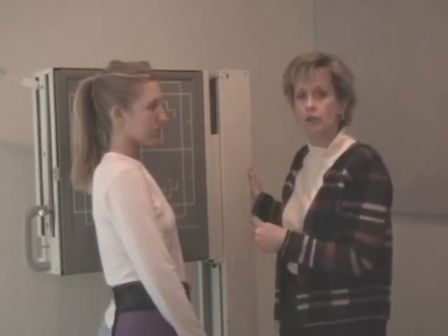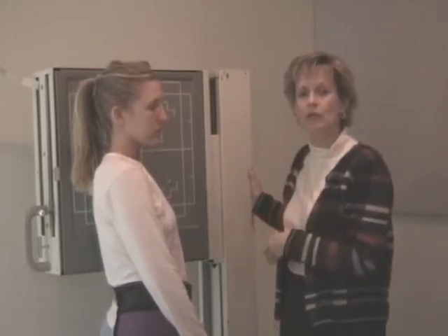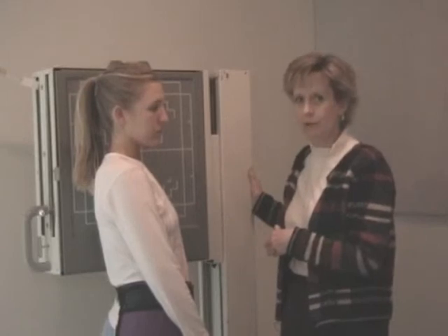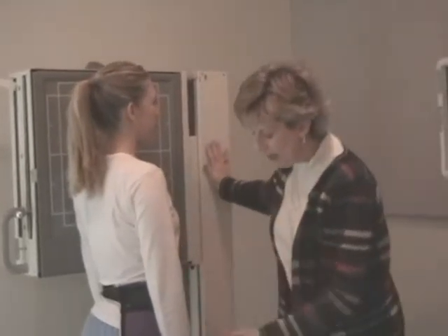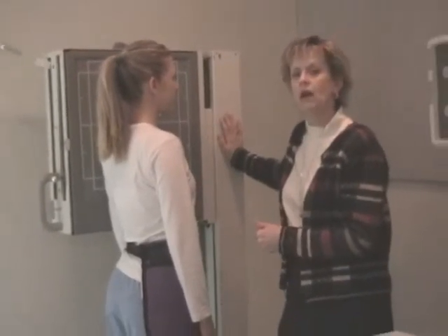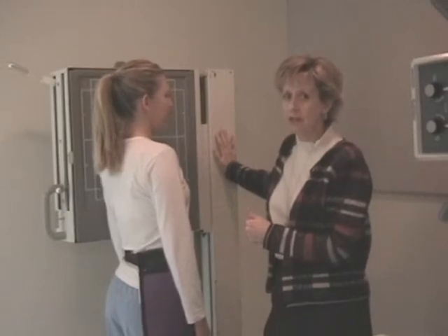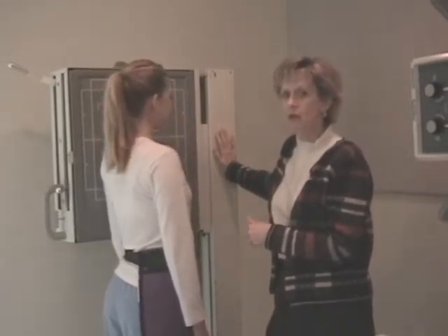Young children with these flipper teeth to save a spot in case they lost a tooth till their permanents come in, or the elderly with dentures. Make sure you put them in a safe spot. So we're going to have our patient stand. I could have them sit, but standing, the exam is fairly quick if they're a walkie-talkie patient, or I could have her sit, or in a trauma situation, which will be in a different lesson altogether, you may do these entirely recumbent.